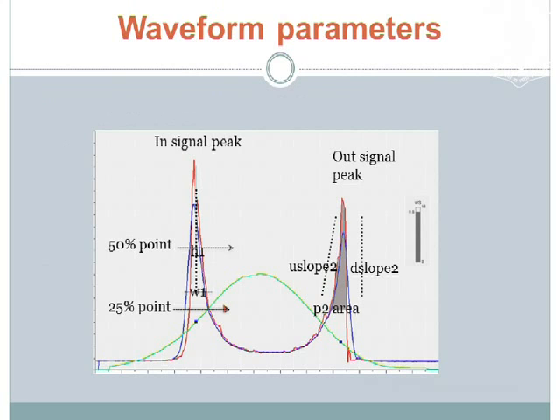So this is a huge list of them, and it is very difficult to understand each and every one of them. But I would just like to mention that most of these, around 40 parameters, can be evaluated, and for the first 24 parameters, all of them are analyzed in the upper 75% of the signal peak that you see, and the rest of them are analyzed from the upper half of the signal peak.